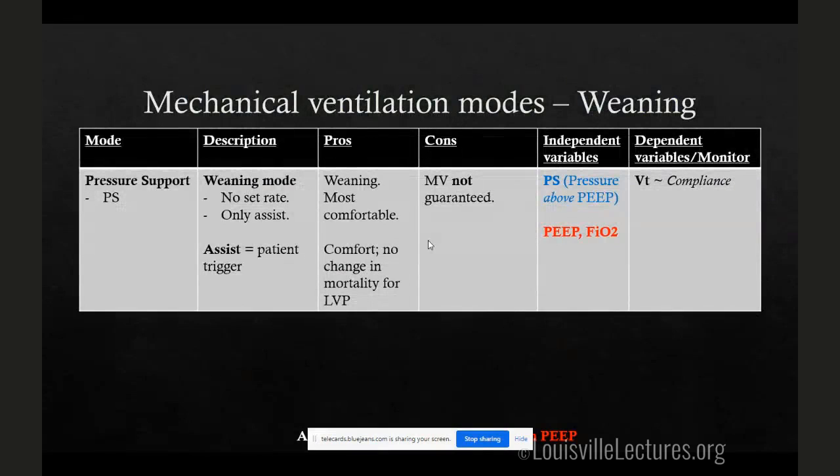This is the most comfortable mode, to be honest with you, because the patient can determine the flow rate, the air, and everything. Sorry, that is incorrect. This is not a lung protective ventilation mode. I apologize, but it is most comfortable.